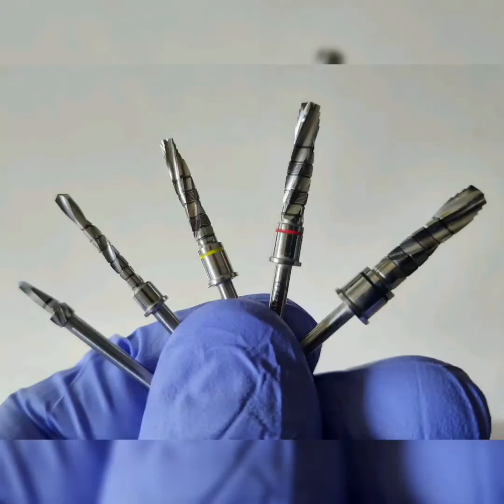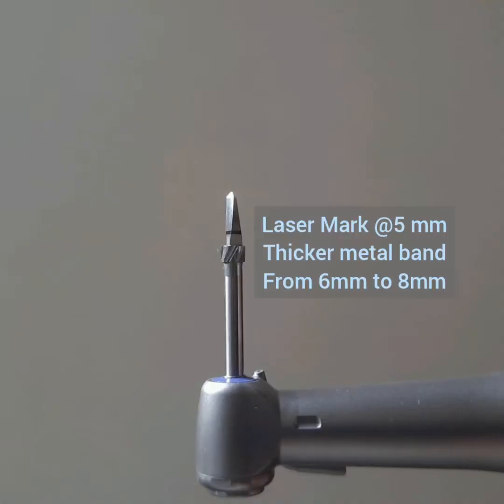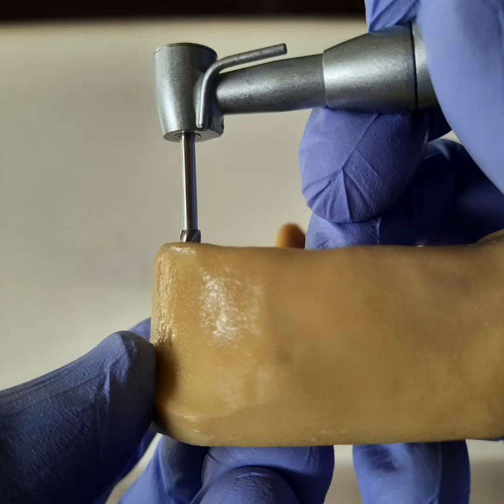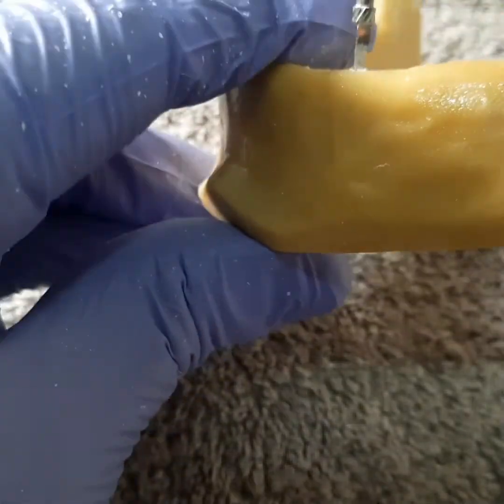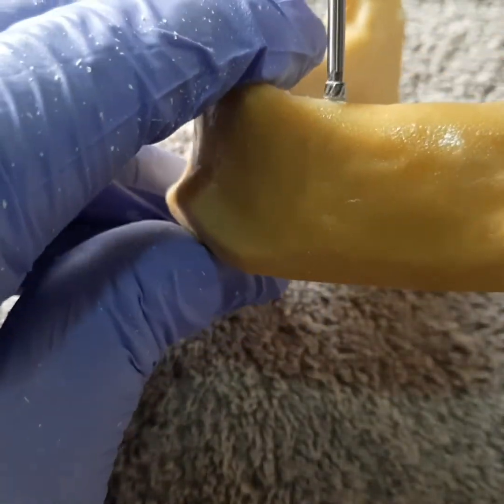This is what the color-coded sequence would look like in summary. The pilot drill — a well-designed tool with a sharp peak or spitzer — is great to begin with, as it helps mark the precise location of the osteotomy site without bouncing off the ridge. The thick metal band provides a 3 mm wide countersink, as you see here in fairly good detail, as I drill to 6 mm first and then to 8 mm.